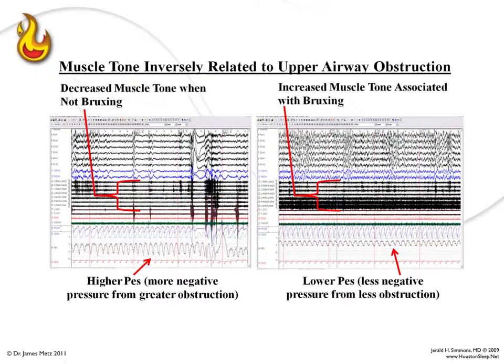And you'll see in the patient on the left that the esophageal pressure is dropping pretty dramatically for quite a while up to the time of the arousal. That's the massive amount of ink there on the left graph toward the right hand side. And you'll see the esophageal pressure drops way down and then goes way up, and that's an arousal where somebody cleared it.